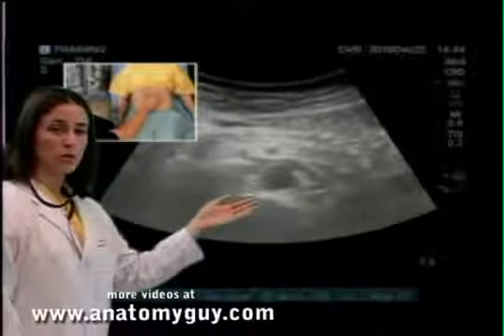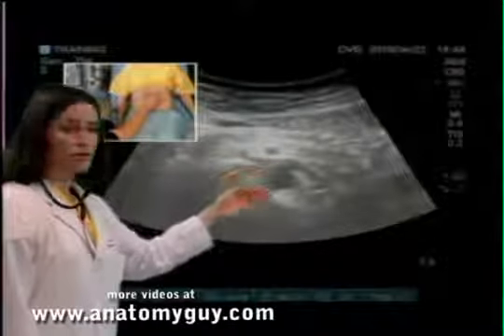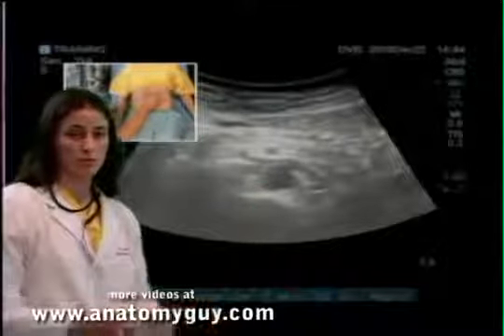Here we're going to want to take our measurement of the proximal aorta. We want to go from this outer wall and measure down to this outer wall. We want these measurements to be less than 3 centimeters in both the proximal and distal aorta.